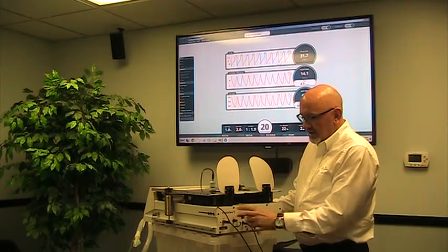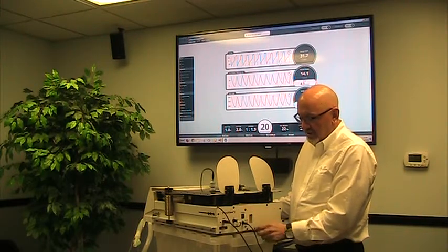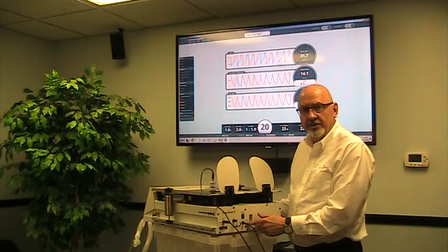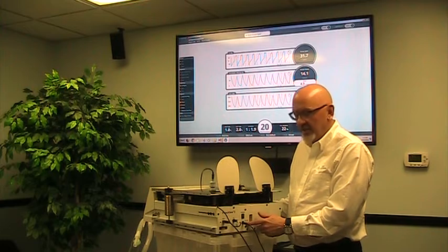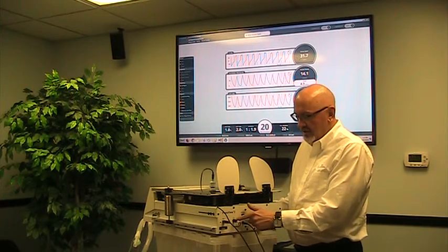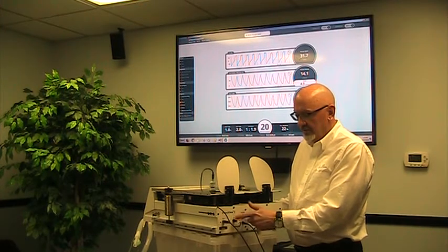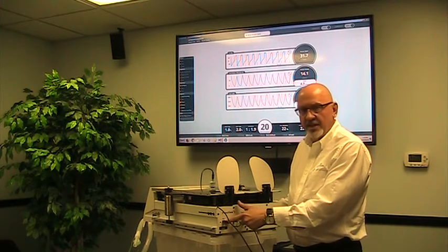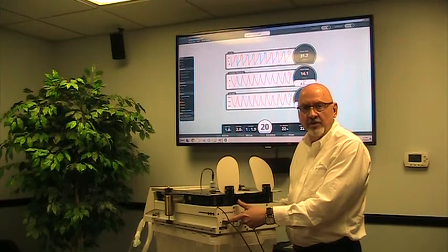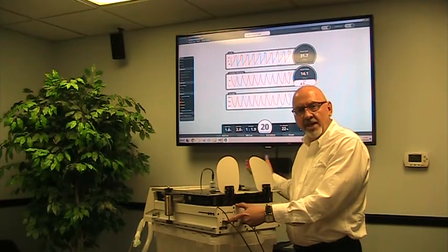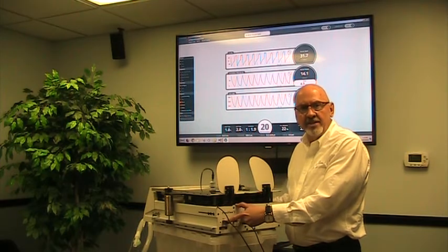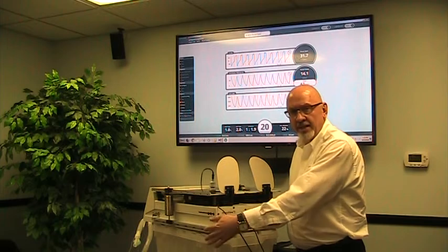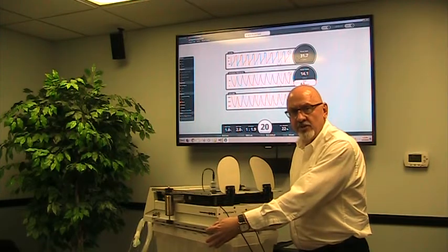These modules have three connections. There is a connection for the 12 volt DC power supply. There's a connection for your oxygen sensor and there's a connection for the USB cable which is going to be communicating with the PC where you're running the NuView software.